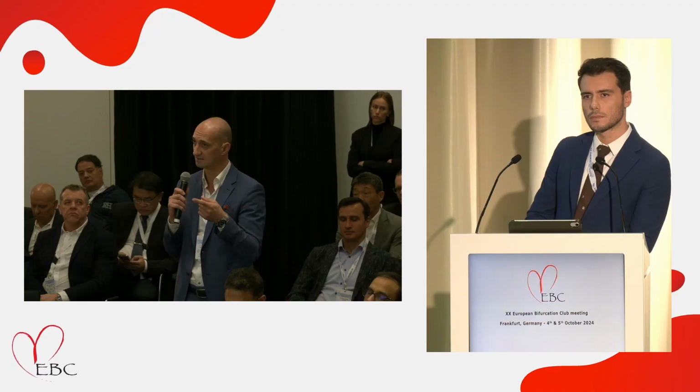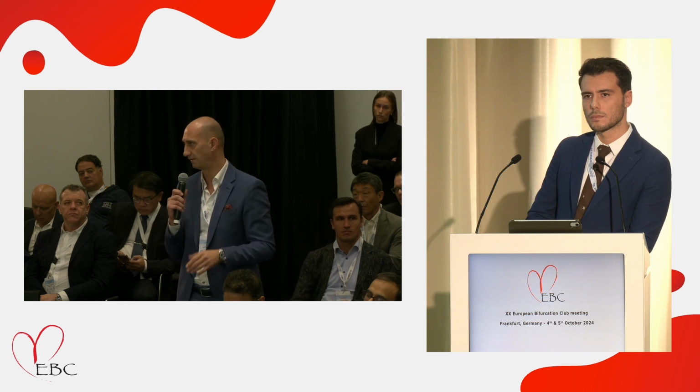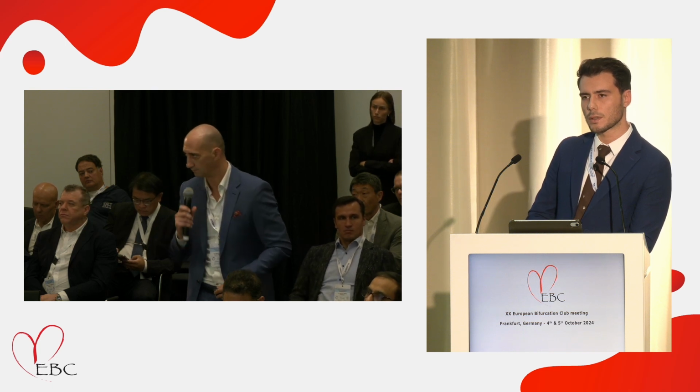That was maybe the pot. I'm not using the pot side pot technique yet, but if you did it with this non-compliant balloon, and maybe if you use it 4.0 on the left main LAD stent, you will finish with the pot side pot, I think. Yeah, this is a good call.